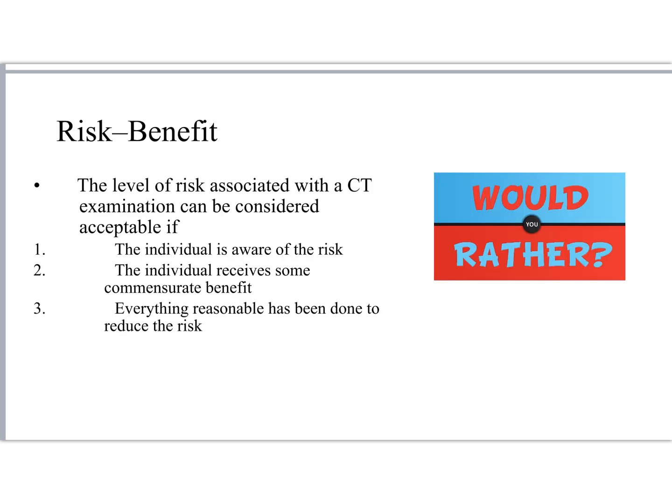So that's the risk and benefit thing. The risk level associated with CT can be considered acceptable if, number one, the individual is aware of the risk. Today we are doing a CT exam. It involves exposure to ionizing radiation, right? Two, the individual receives some commensurate benefit. The benefit of doing today's exam is we can figure out whether or not you're having a stroke, right? And three, everything reasonable has been done to reduce the risk.